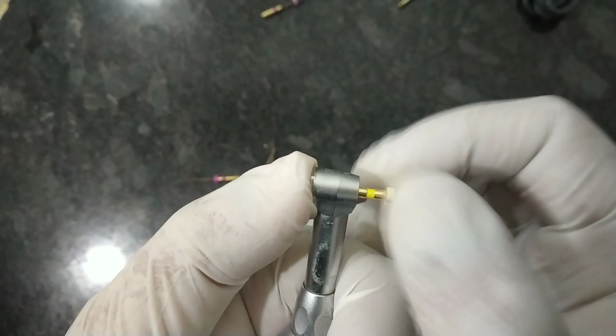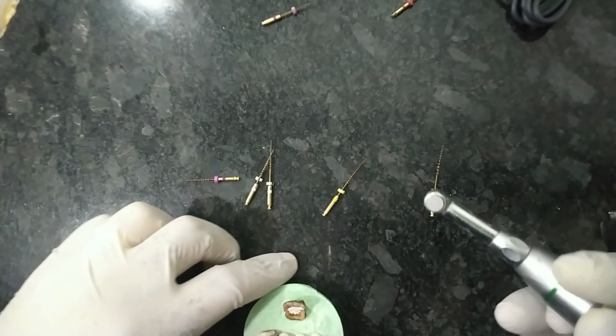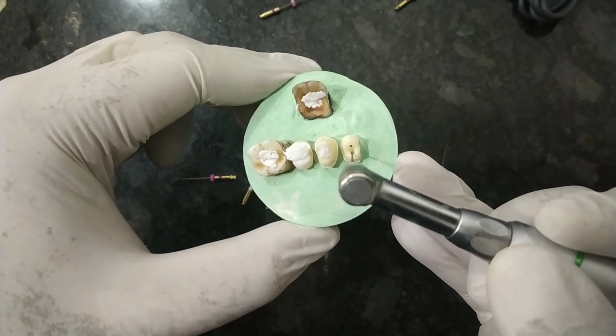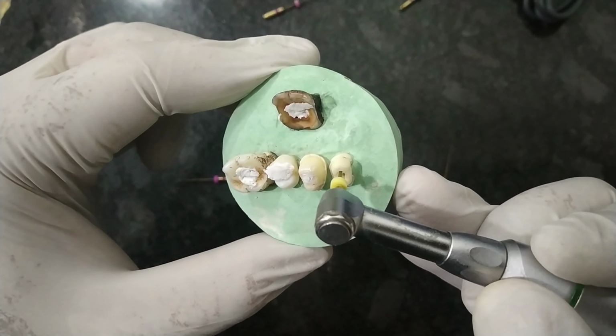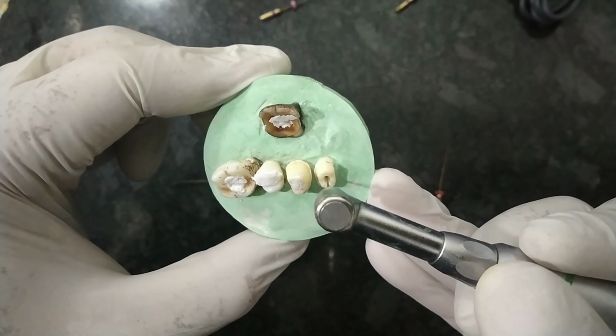So this is another file. Now I have inserted it. Since I have already prepared it, as you can see, only one stroke has to be there.